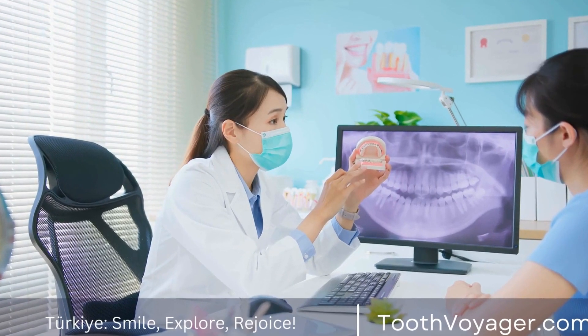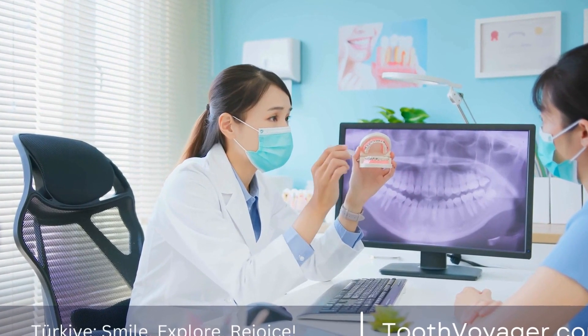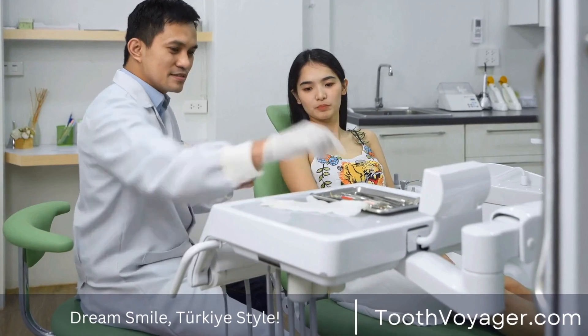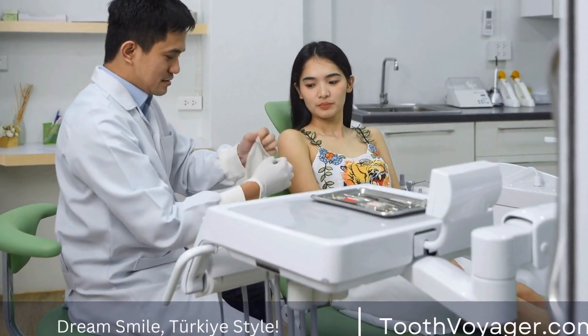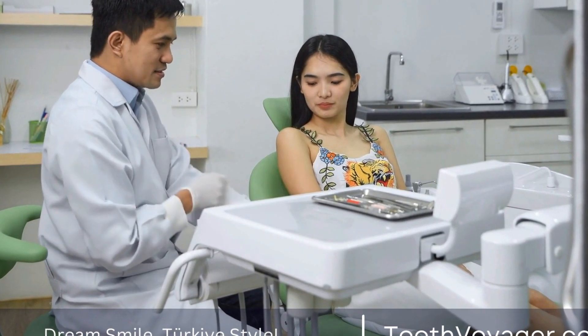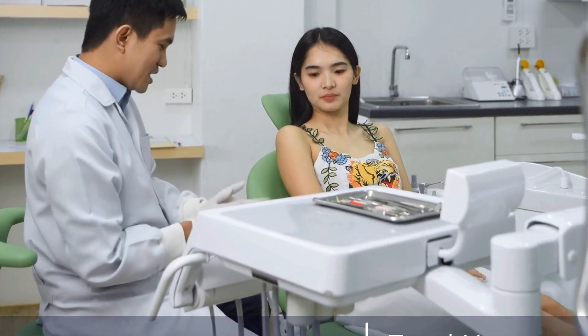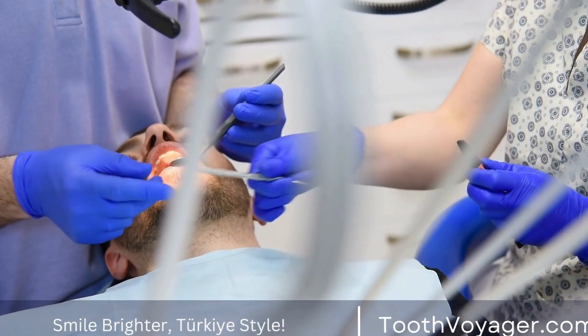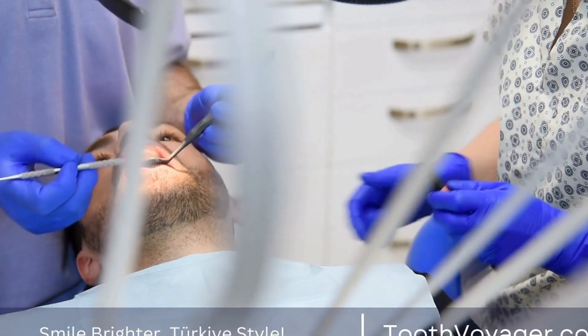Dental veneers have become an increasingly popular option for individuals looking to improve the appearance of their smile. These thin, custom-made shells are designed to cover the front surface of teeth to improve their color, shape, size, or length. In this video, we will explore the journey from concept to smile in the creation of dental veneers.